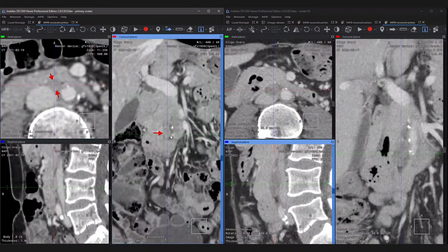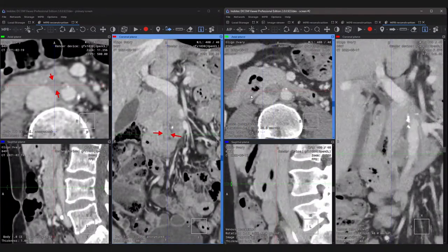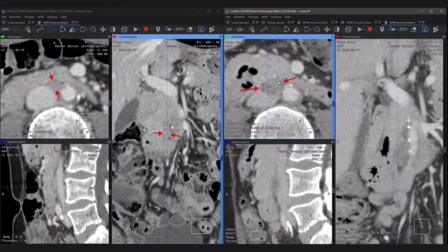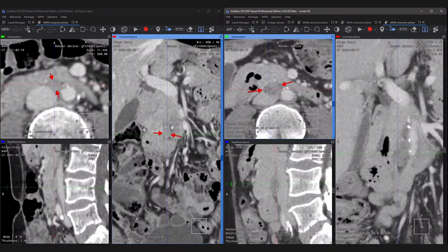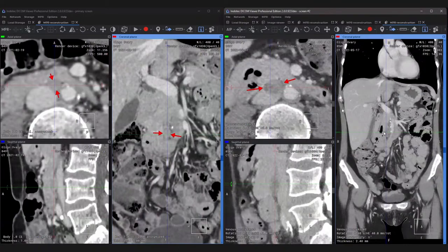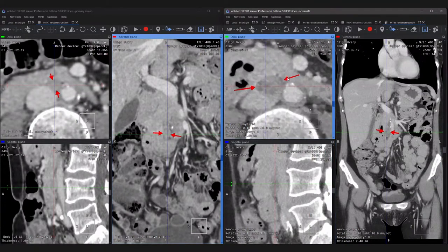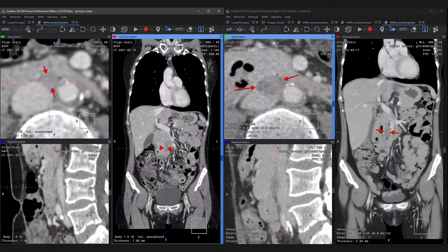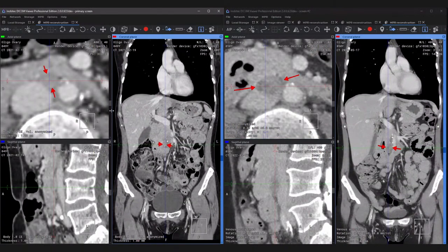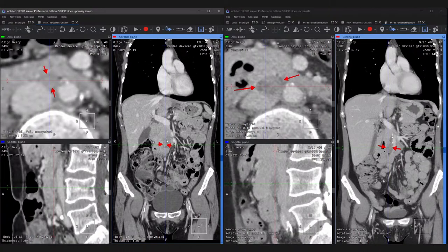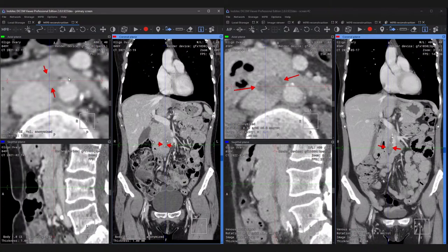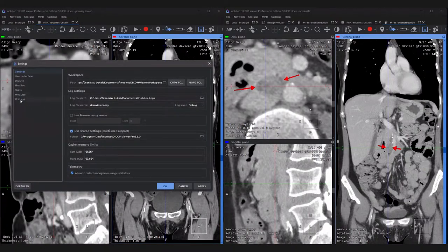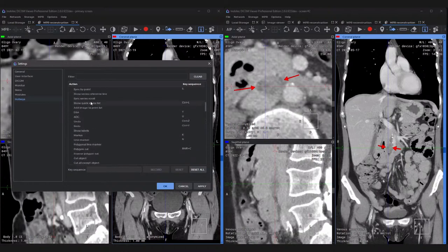I'm now switching to the 3D MPR pointer. A small metastasis in the mesorectal fat, which is not a frequent finding in lung cancer. So this case shows us actually the basic options of 2D image viewer and MPR reconstruction views, which I really rely on a daily basis. What I find very helpful is that windows in the MPR view can be zoomed independently. We can show the lesions very zoomed in in one view and show their exact position in an unzoomed image in the other views.